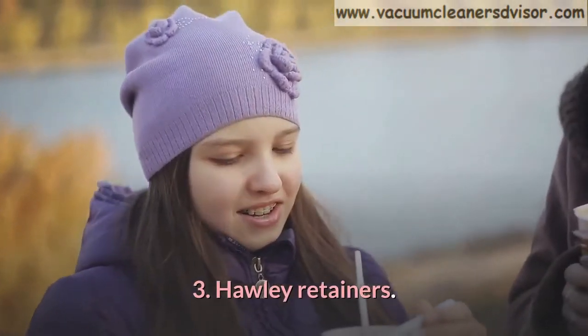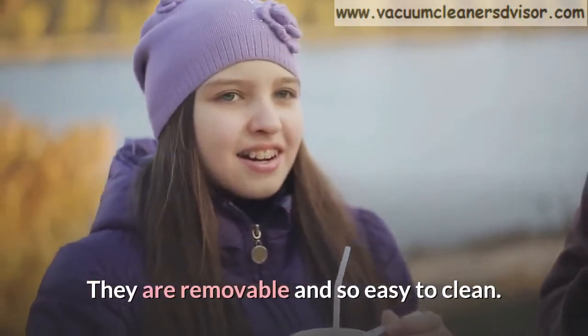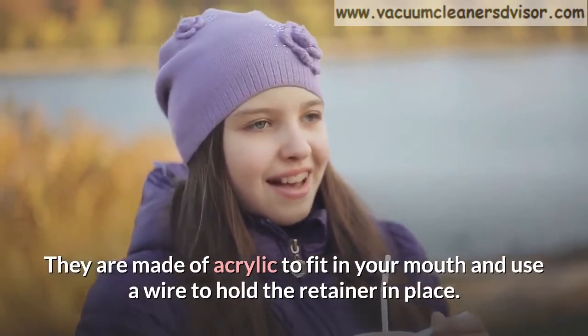Number 3: Hawley retainers. They are removable and so easy to clean. They are made of acrylic to fit in your mouth and use a wire to hold the retainer in place.